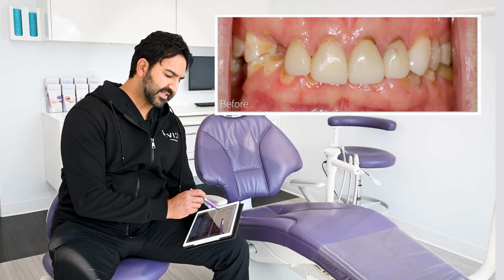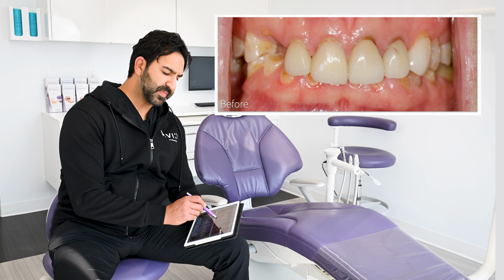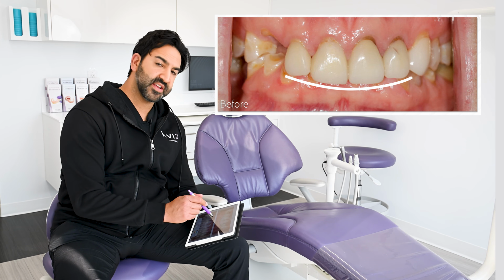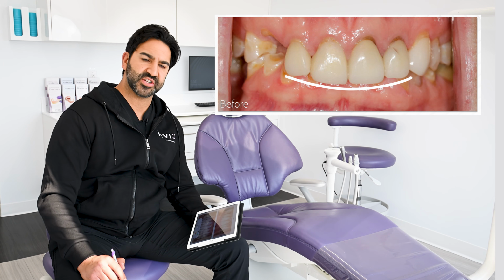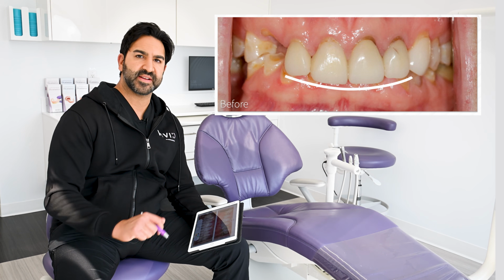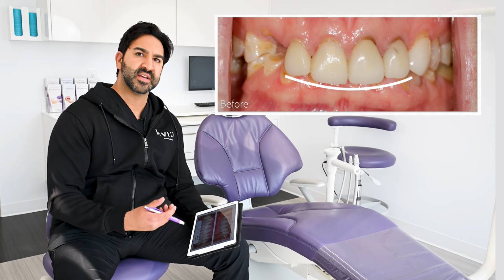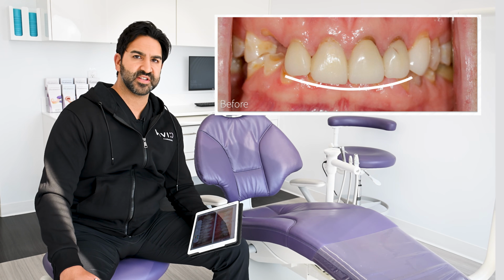So here you can see that due to the wear of the lower arch, the patient's bite has deepened. The incisal edges significantly overlap the lower teeth to the point where you can't even see them when she smiles. This patient has become overclosed from all of the wear and requires her bite to be opened. This can be done by utilizing crown restorations or, in this particular case, using dentures to restore the form, function, and aesthetics of her teeth.